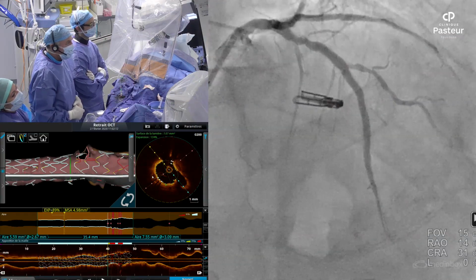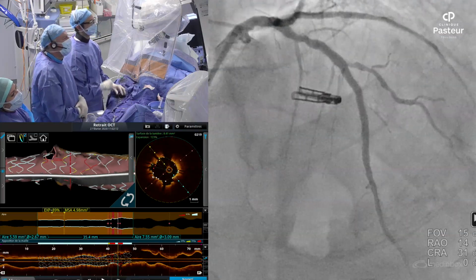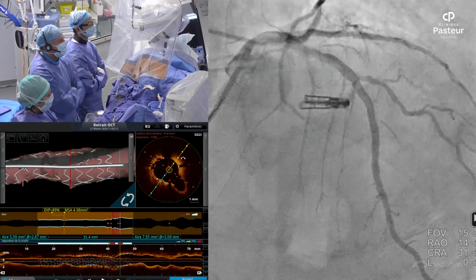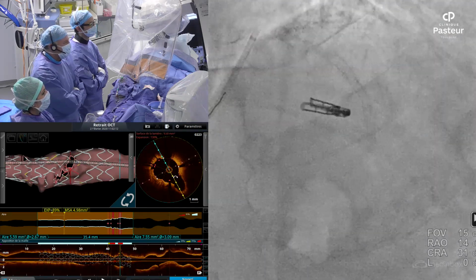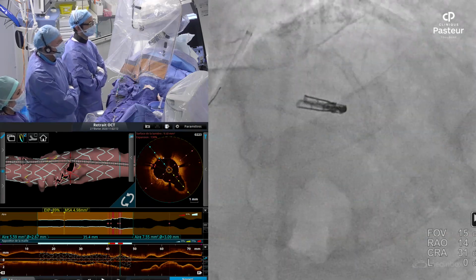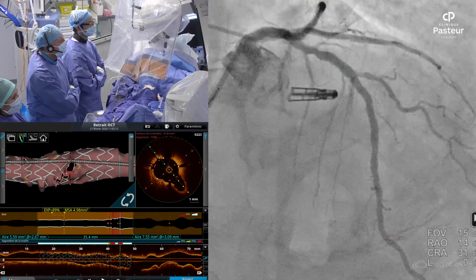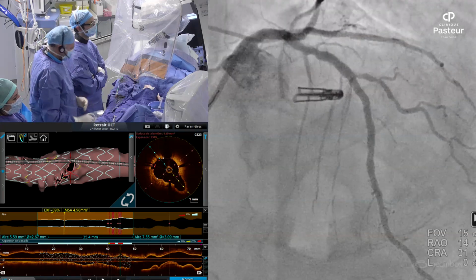Well, of course we do, because when you can stick to plan A, that means that the plan was correct and everything went as expected, which is the best way to work. And if I may remark again, something that I find really overwhelming is treating these complex old patients totally by transcatheter medicine. The valve, the circumflex, the culprit lesion, the complete revascularization, the side branch, the final imaging. It's amazing all the potential we have to take care of these patients.